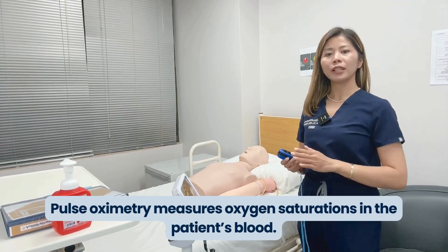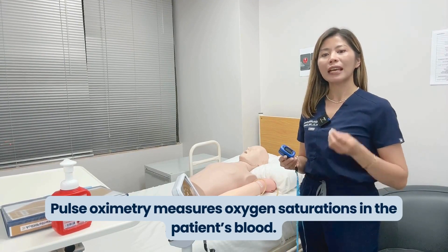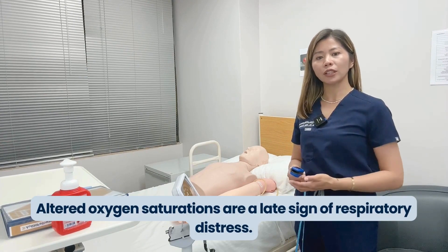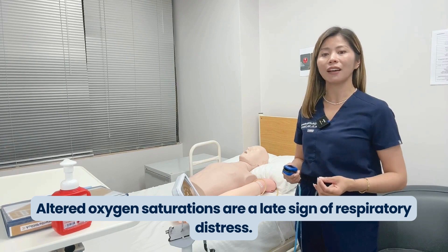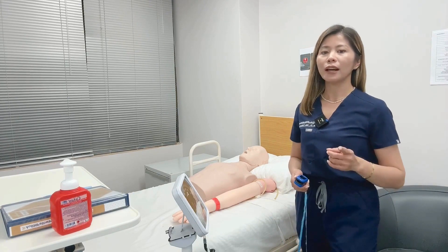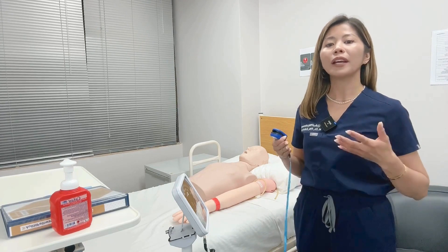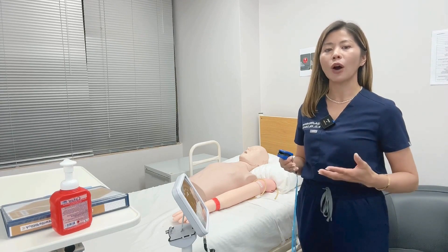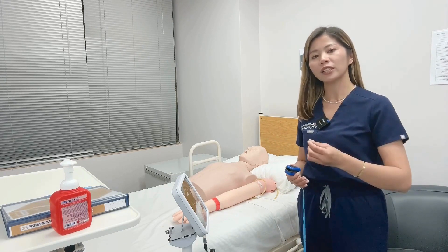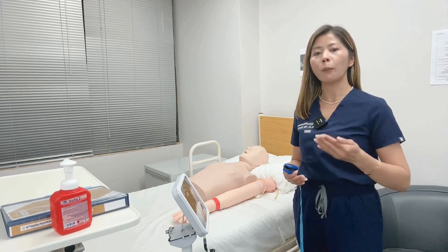Pulse oximetry measures oxygen saturation in the patient's blood. Now, altered oxygen saturations are a late sign of respiratory distress. Initially, the body will try and compensate for hypoxia by increasing the rate and depth of respirations. By the time the oxygen saturations are decreasing, the patient is usually very compromised.